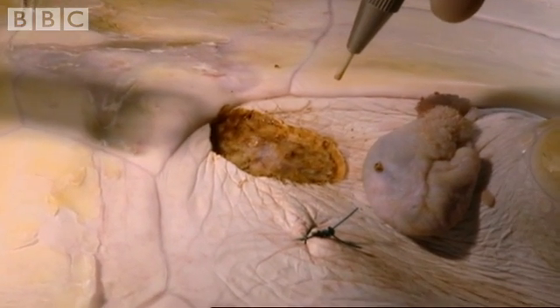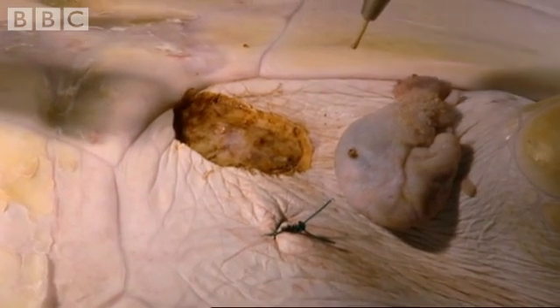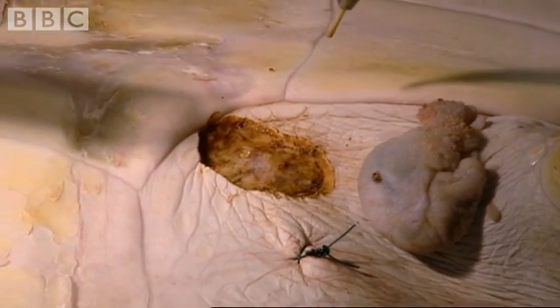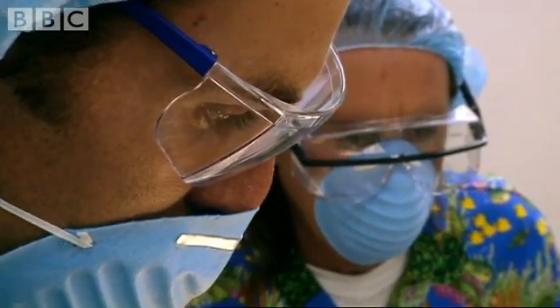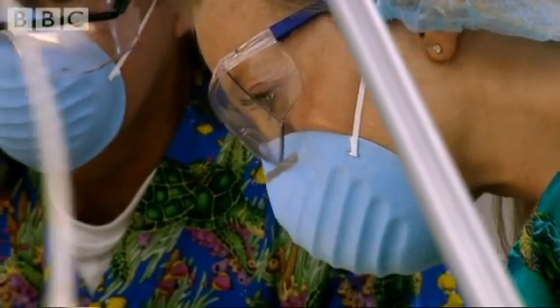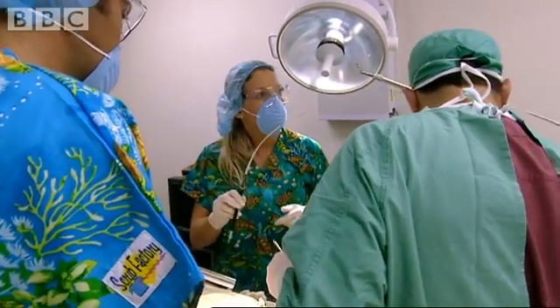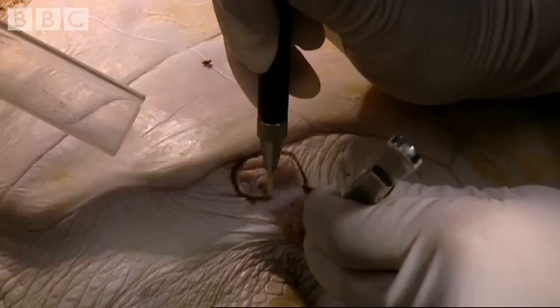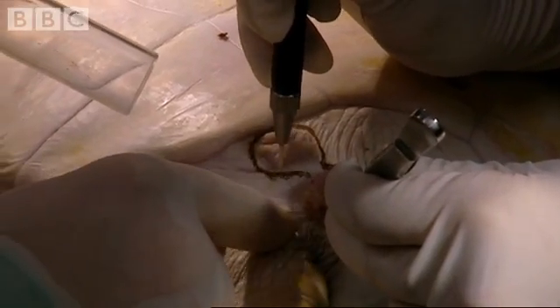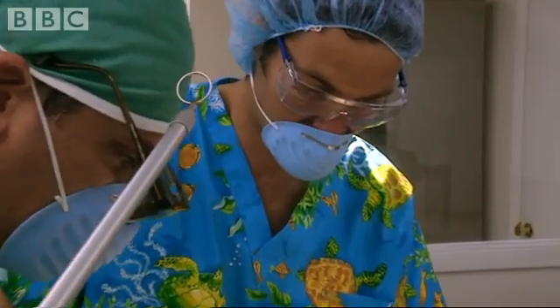This is called a defocus beam. Watch the wound — watch it shrink up. Isn't that neat? It'll be about half the size of the original wound by the time I'm done. That is amazing. It's the first time Steve and I have worked with lasers, but the advantages are many. Not only does it seal the skin as it cuts, but with no physical contact, there is no risk of contaminating the wound.